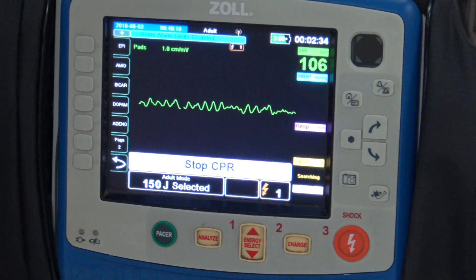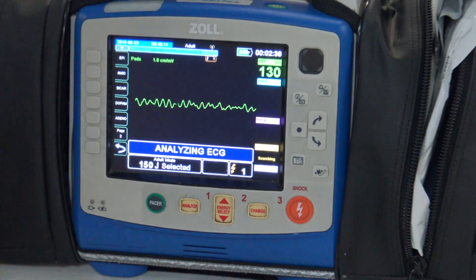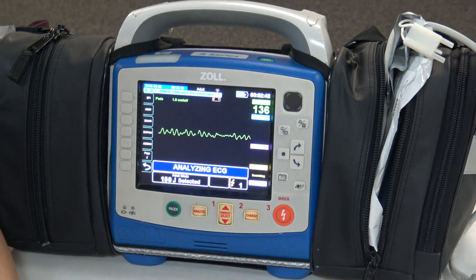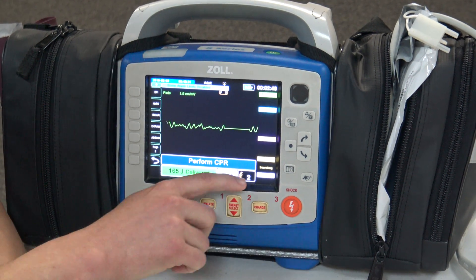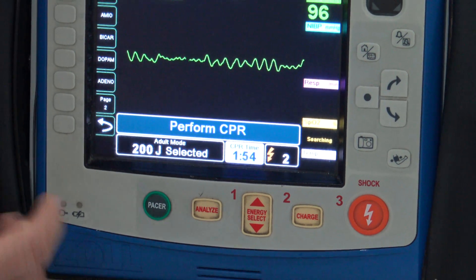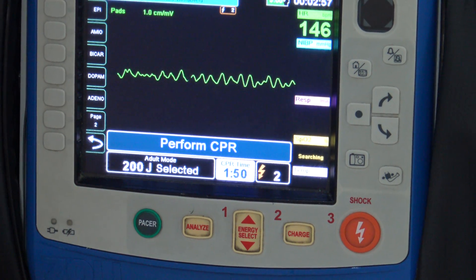Stop CPR — two minutes is up. We're stopped, hands are off, and clear. Press shock. We've got another shock advised, and as you can see it's moved up to 150 joules. The total number of shocks goes to two, and the timer comes back to two minutes to start counting down again. The next one is set up for 200 joules.